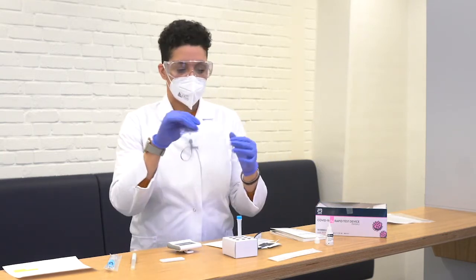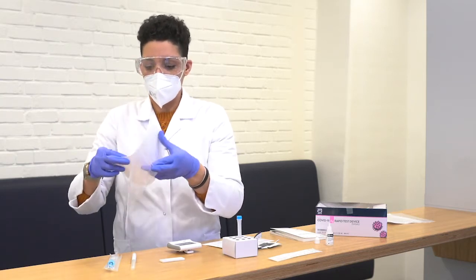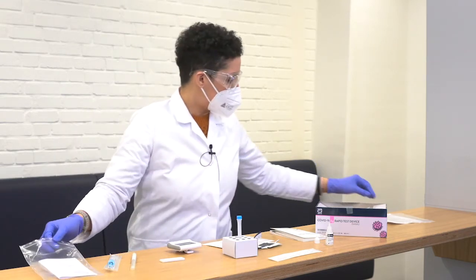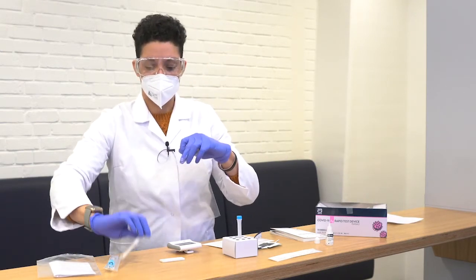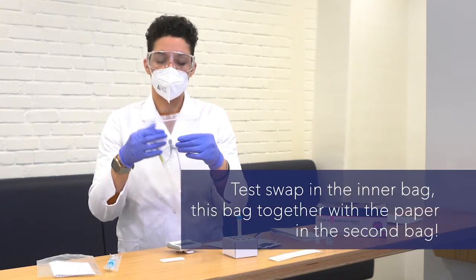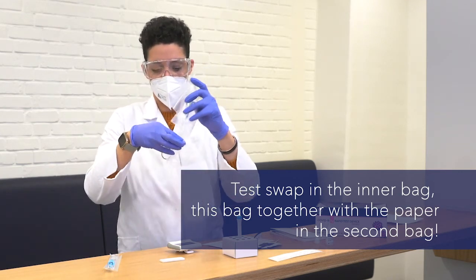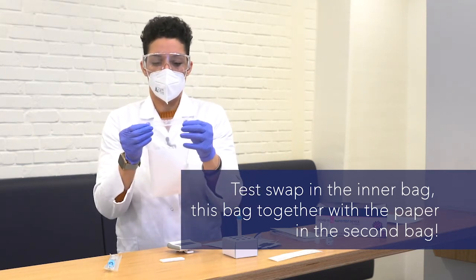Then there also comes 1 bag that you're going to have to enter the written paper. Just fold it up 1 time so not everybody is going to see all your information. Fold it up. Now take a second bag and enter the test itself. It's very important that the test is going to be in an individual bag and not with the sheet itself. So enter the test inside an individual bag and then enter this individual bag with the paper in the other bag.